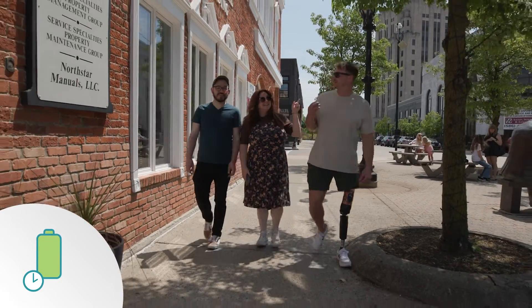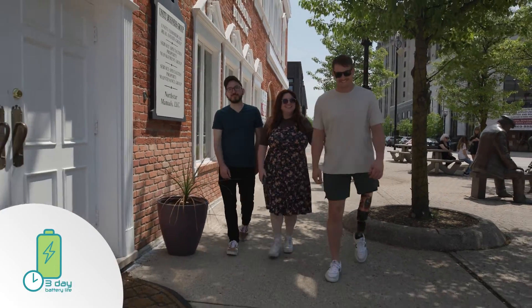The battery life is awesome. It's probably one of my most loved things about this knee — not needing to charge it every night. Just how active I am as a person, I can go three days without needing a charge, and it just saves you a lot of stress.